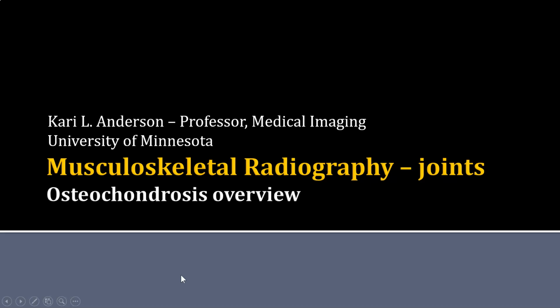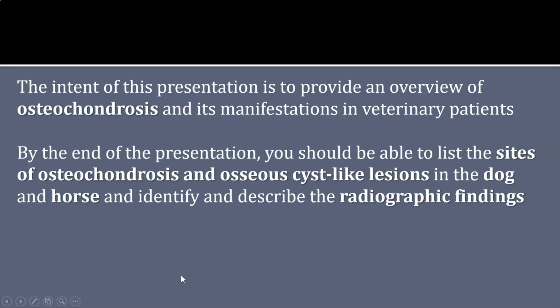This is the third in a series of presentations on radiography of joint disorders in veterinary patients. This presentation is to provide a high-level overview of osteochondrosis and its manifestations in the patients you may encounter in your veterinary practice.